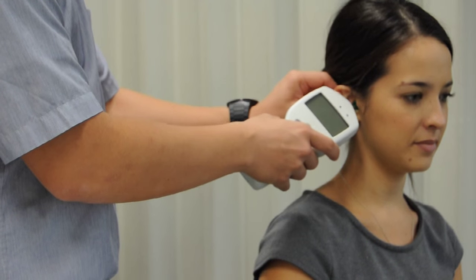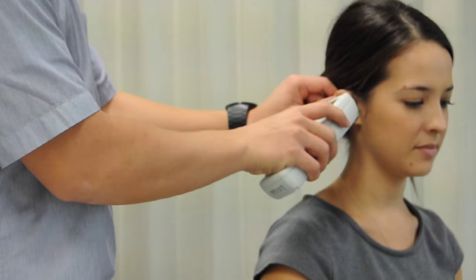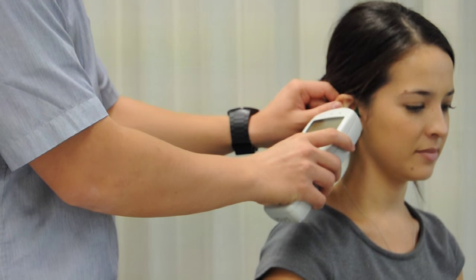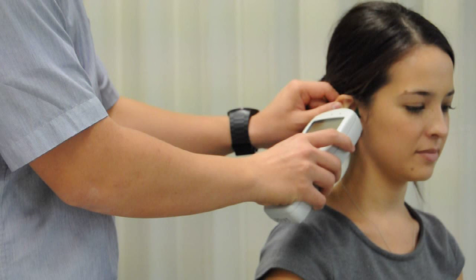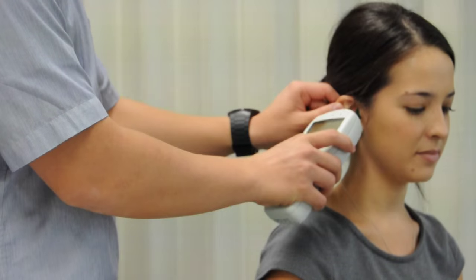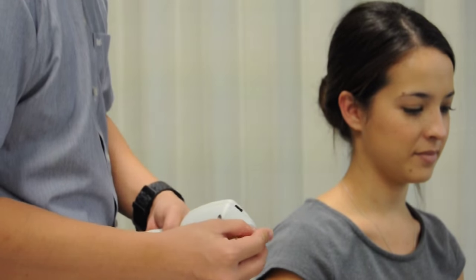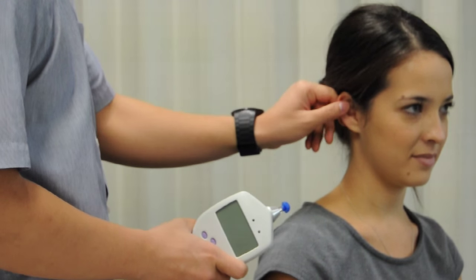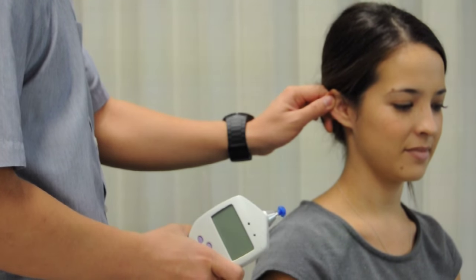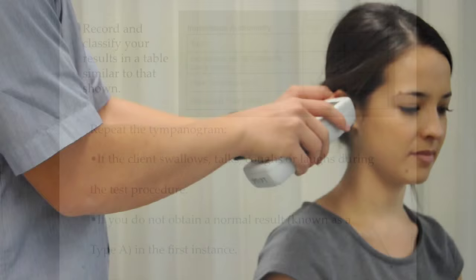Establish a seal by placing the tympanometry tip into the ear canal. The test will automatically commence once the seal has been obtained, and this is usually indicated by a green light appearing on the tympanometer. If a yellow or red light is displayed, this usually means you haven't obtained a proper seal or that the tip is occluded. You may need to use a larger tip, use some aural gel, straighten the ear canal more, or manoeuvre the probe a little deeper into the ear canal.